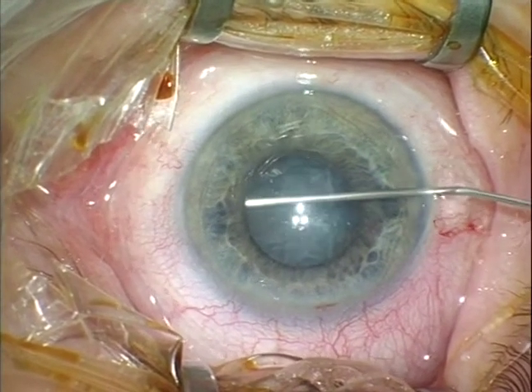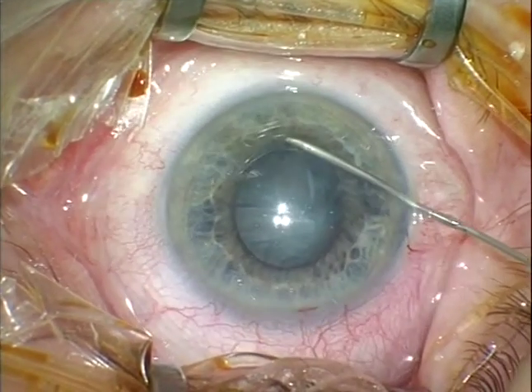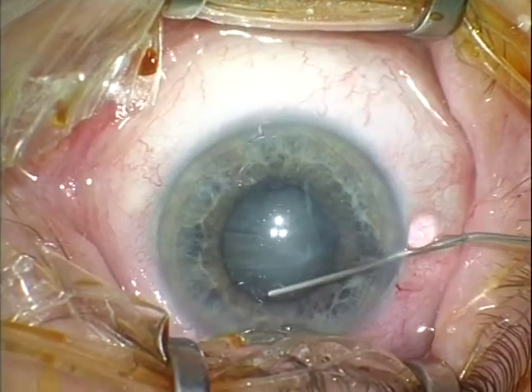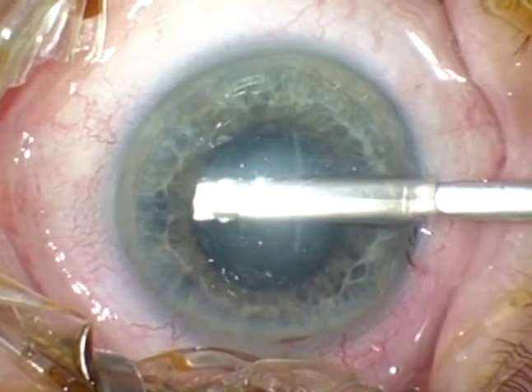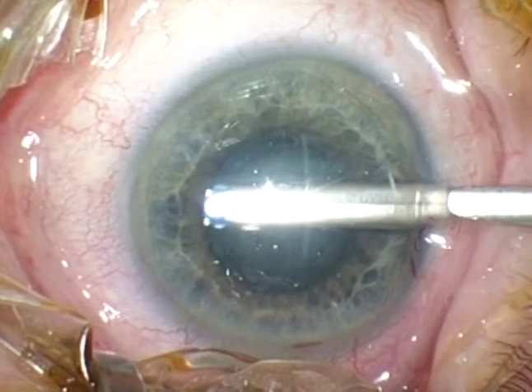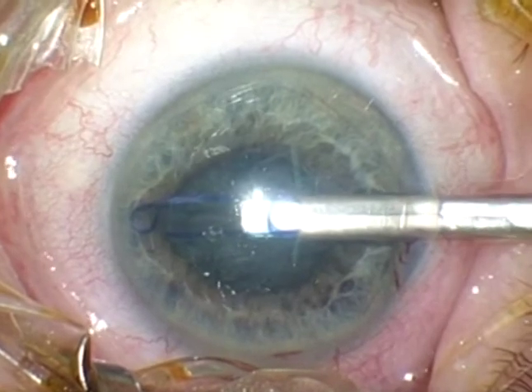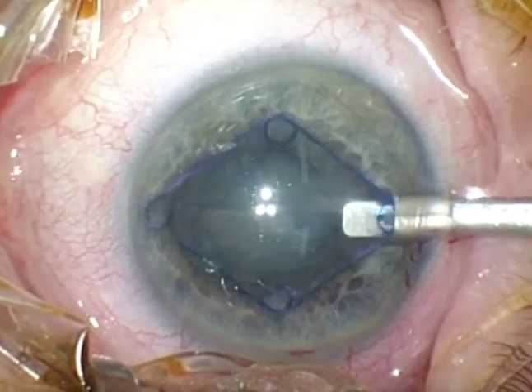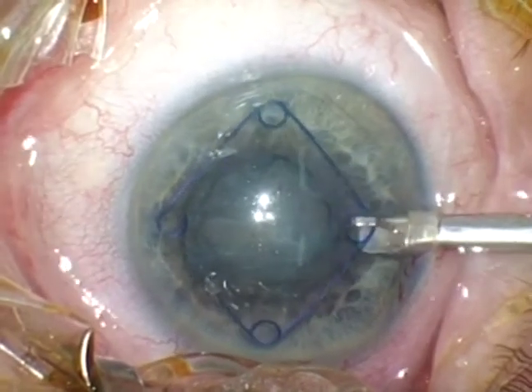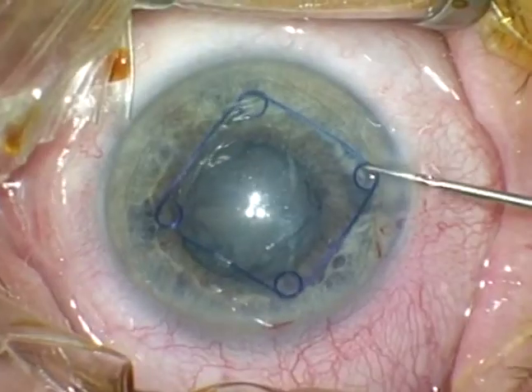Sufficient hydrodissection is very important to mobilize the nucleus. It is specifically useful in small pupil cases. The decision was made in favor of implantation of the pupil expansion ring, which is now being done by placing the device inside the anterior chamber with the specific injection device.